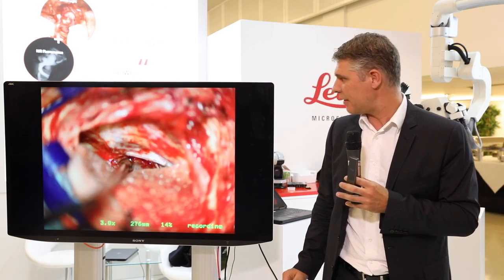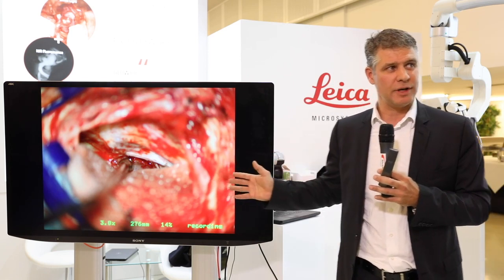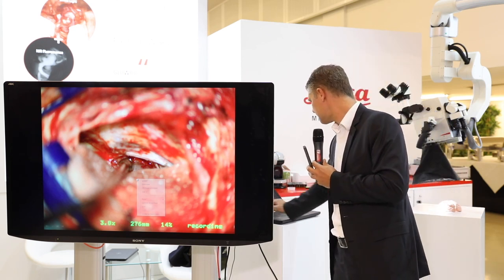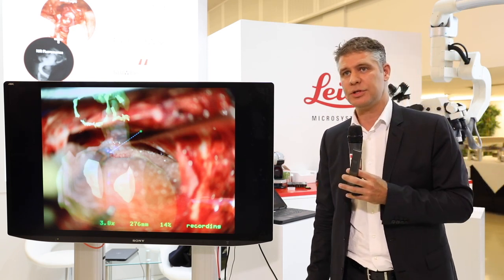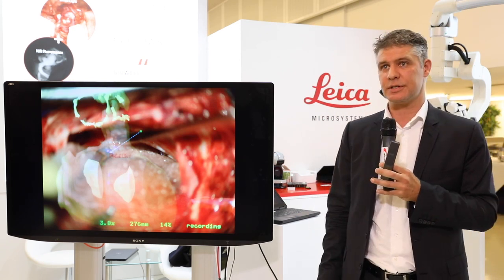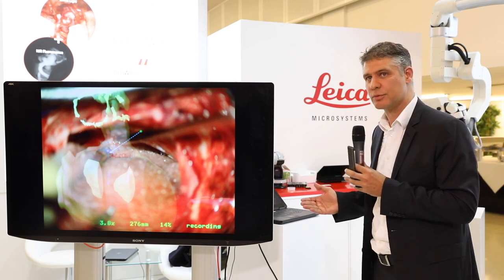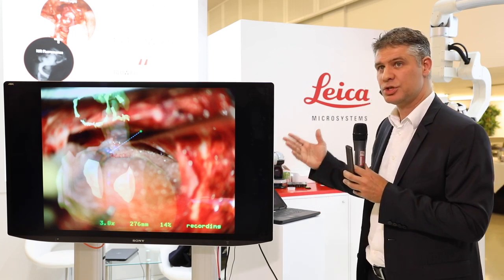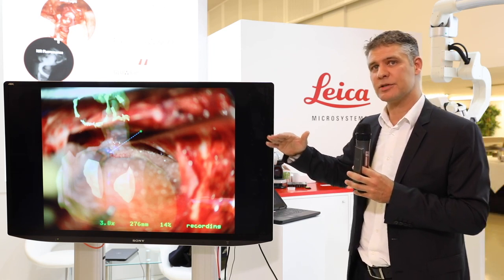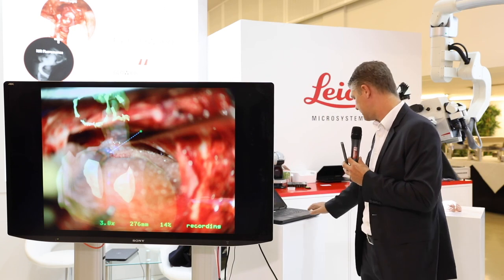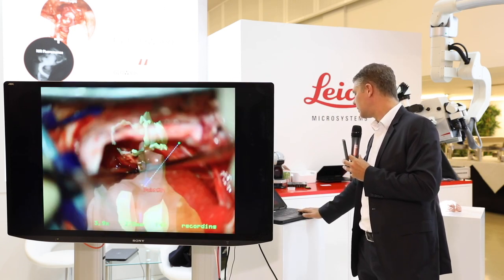A little later in the surgery — if you didn't follow the procedure, it's difficult to know the anatomy. But with the overlay it's much easier to see the schwannoma, the auditory canal, and the vestibular system. We drill the bone on top of the auditory canal, which is quite close to the vestibular system. I shifted the overlay away to know the distance between the edge of the bone and the vestibular system, and I know that distance can be drilled without problems.